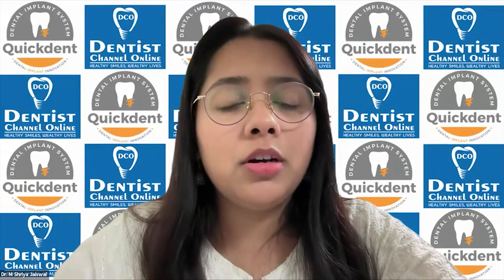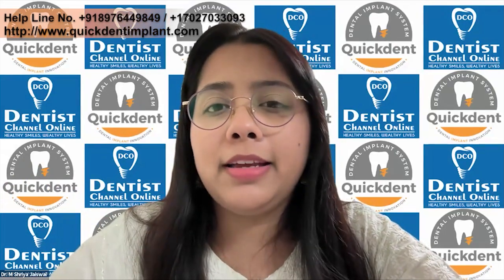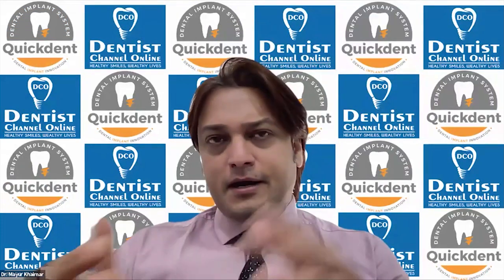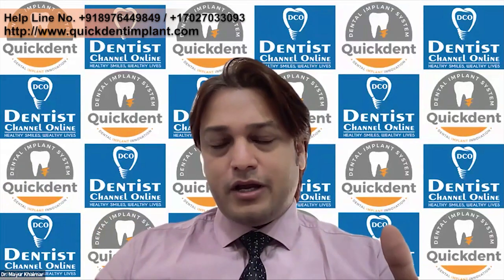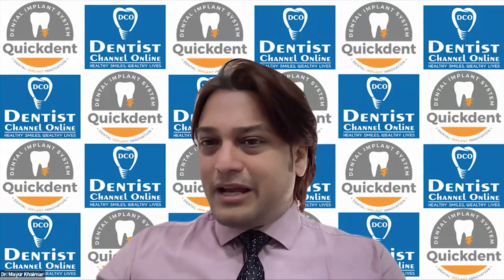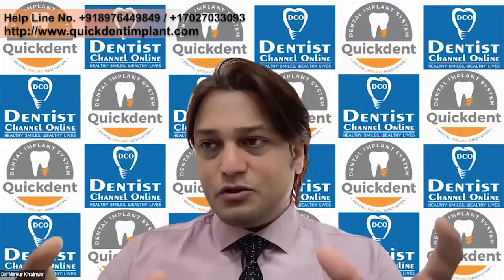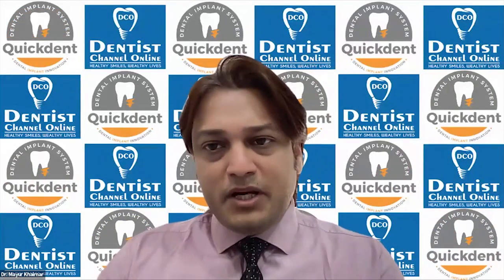Okay. Next is from Atul Goyal. Is it compulsory to load TPR implant in 7 days like BCS? Well, I told you already, if we are getting a good collective torque of all the implants, then we can load the implants, no problem. But if we don't get the torque, and the implant is still in the bone and the bone is very soft, you put the cover screw, close it. You don't have to load it immediately.